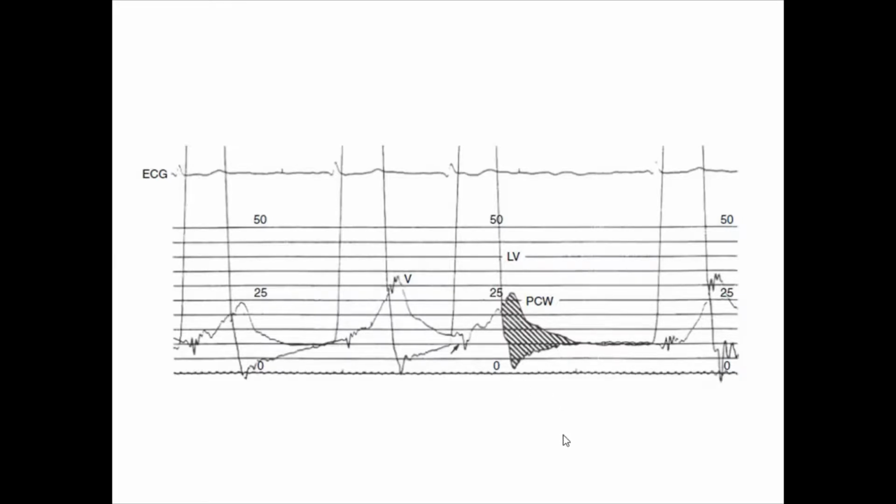Okay, excellent. Go ahead. So LV, pulmonary capillary wedge pressure, simultaneous hemodynamic tracing, scale of 0 to 50 plus, ECG in atrial fibrillation. What are the findings? LVEDP seems not so high. If this is 50, each one is around 5, so LVEDP is around 10. It is not high. And we have a prominent V wave, with high pulmonary capillary wedge pressure. The V wave is around 25.